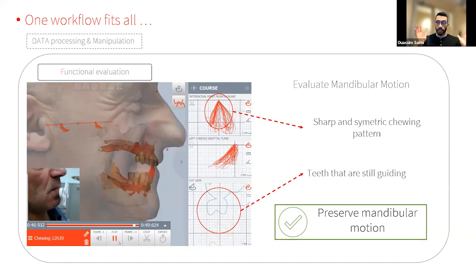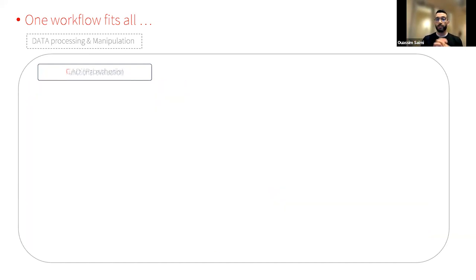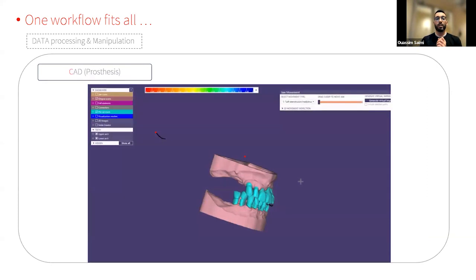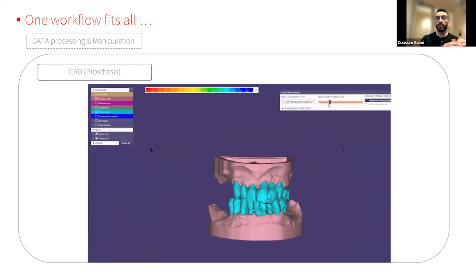And then we said, okay, even if the teeth are not perfectly shaped, he's giving a good pattern of the chewing. So I can use the movement to give the perfect shape on the teeth after. So we decided to keep also the motion. So for me, the avatar is green. Do you remember? Avatar is green. So straight to the next step.